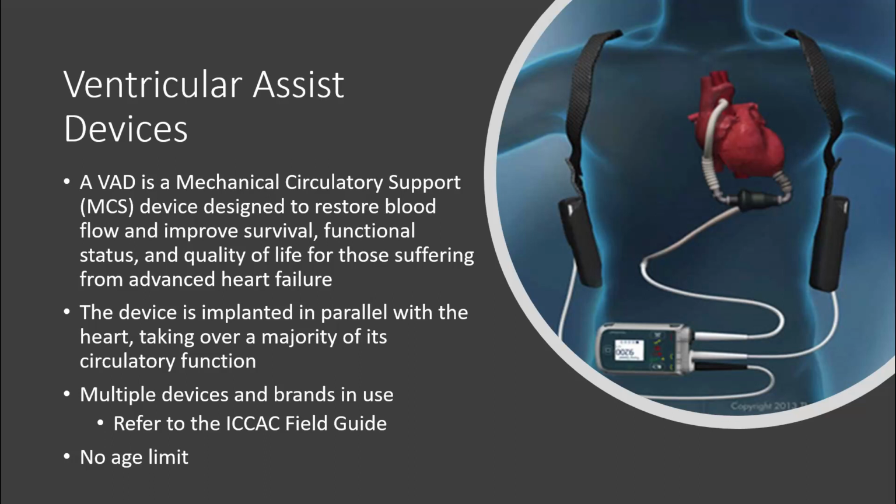Now, who can get a VAD? Really anybody, as long as their chest is anatomically big enough to hold the impeller, and these are getting smaller and smaller every day. Generally speaking, you're looking at larger peds and kids, or peds and adults. The really small infants, neonates, their chest just simply isn't big enough for this. But like I said, these are getting smaller and smaller every day, so it's entirely possible that in 5 years, 10 years, that may change.